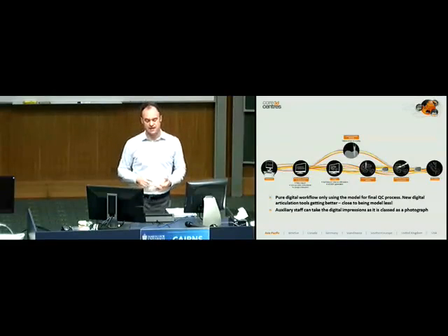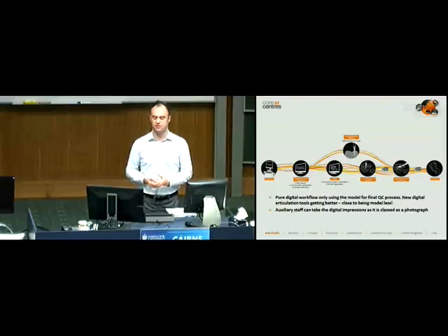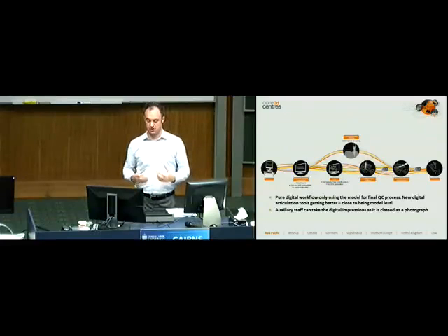They can also now take that file and start to work on it digitally using some software, an open architecture laboratory scanner and software called 3Shape. So they can take the file, put it into their own software and start designing your crown. So it's instantaneous. The minute you send it, it appears, and they can start working on it almost immediately. The only problem with that is it's almost too fast, because if they do want the model for QC, they have to wait about 3 days for that to arrive, because it has to be milled and sent. So you take the scan, it gets sent to a laboratory, they can either work on it immediately, or they can wait for the model.